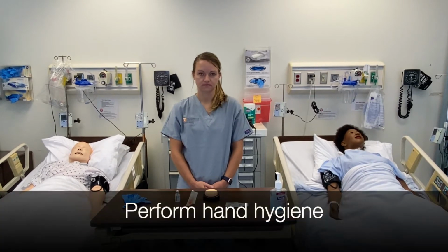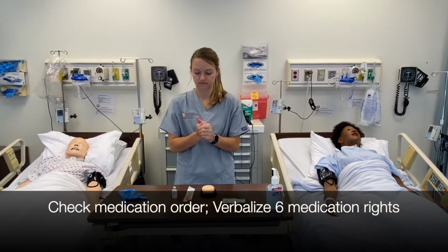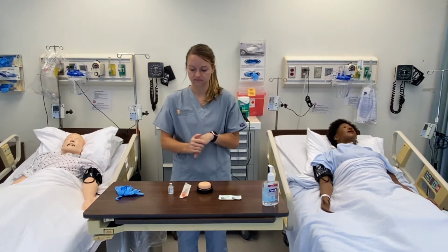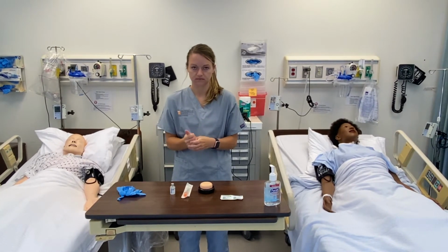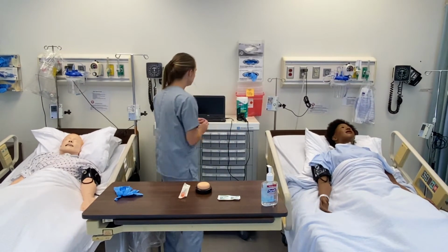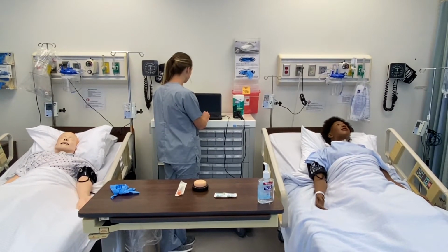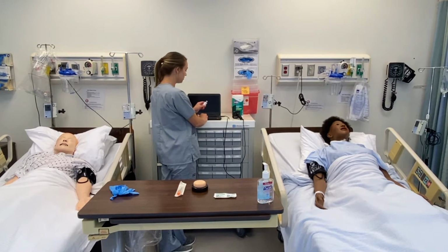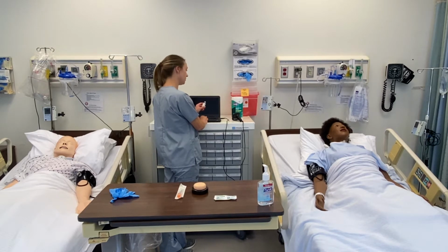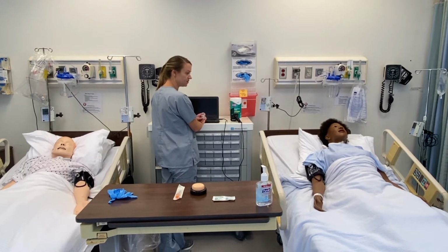Perform hand hygiene with sanitizer. Check medication order and verbalize 6 medication rights prior to medication preparation, including right patient, medication, dosage, time, route, and documentation. I'm going to check my computer for the order, and I see that I'm supposed to give insulin SubQ now. I'm going to give 10 units according to the sliding scale because her glucose was 250, and I'm going to give it to my patient, Susan.